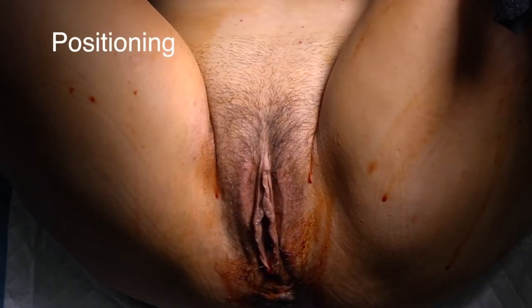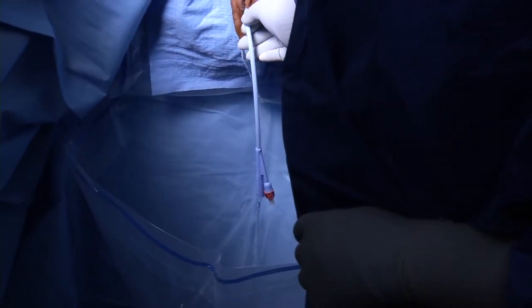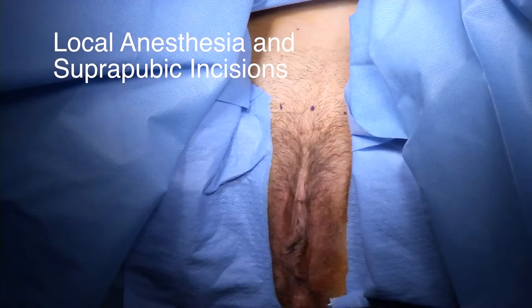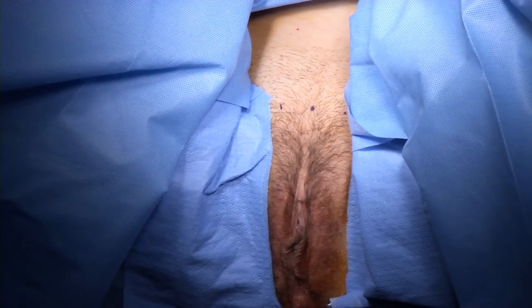We typically perform this procedure under deep sedation with local anesthesia. The patient is placed in dorsal lithotomy position and prepped and draped in normal fashion. The table is placed in Trendelenburg. An 18 French Foley catheter is used to drain the bladder. The midline is marked one finger breadth above the symphysis and the 3 mm suprapubic incision sites are marked 2.5 cm laterally on either side.